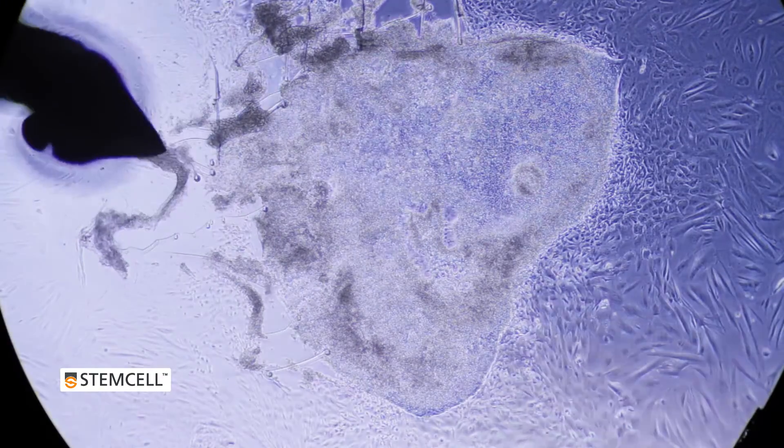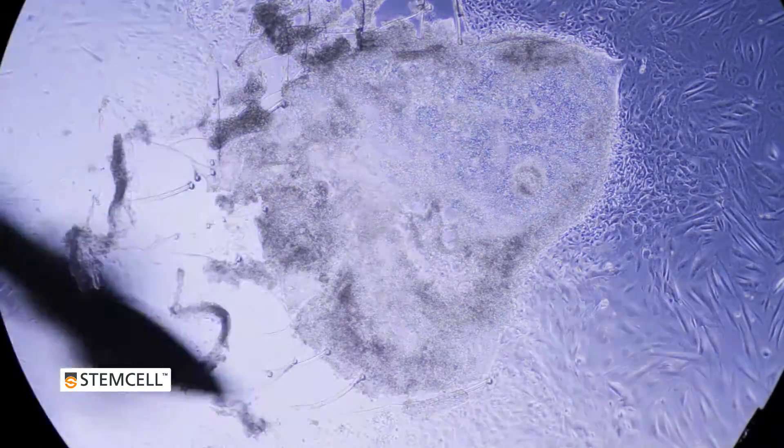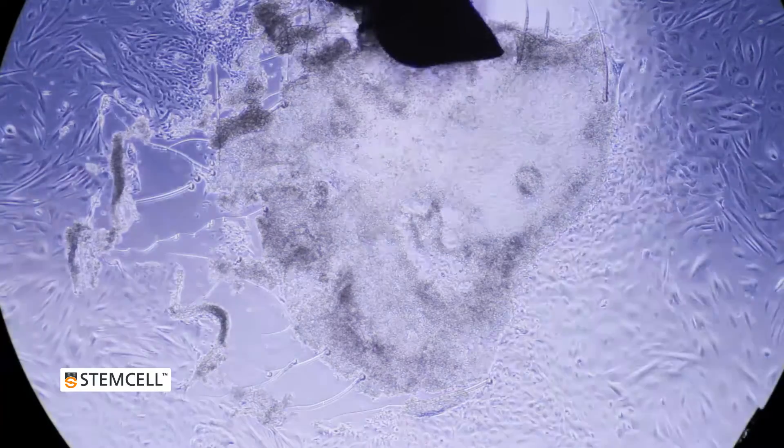Gently and carefully drag the needle away from the colony, pulling the surrounding fibroblasts with you. You do not have to use force. The fibroblasts should pull away from the colony easily.